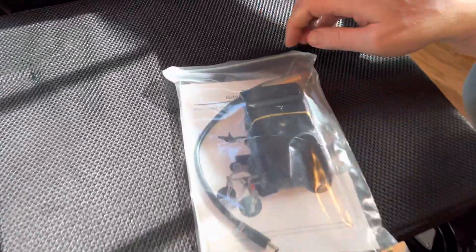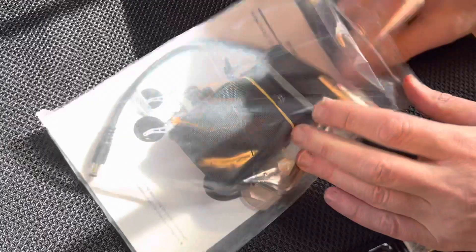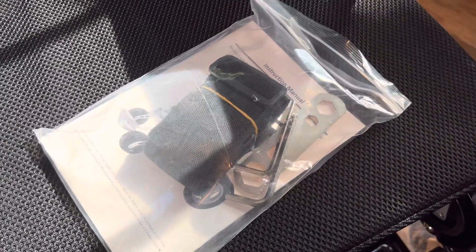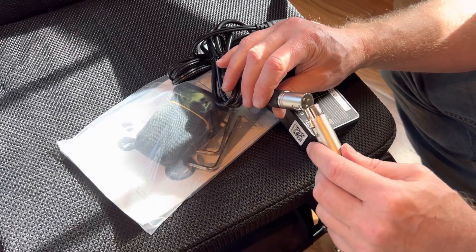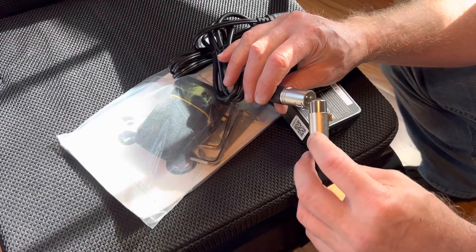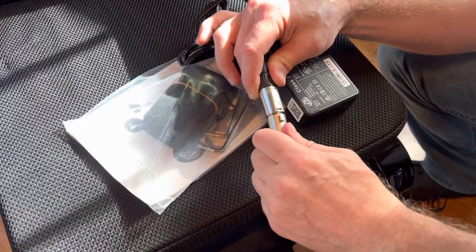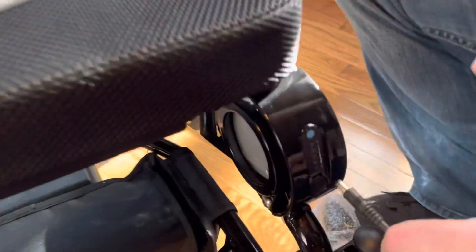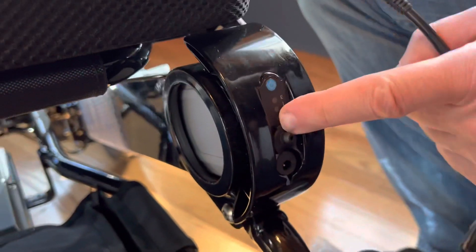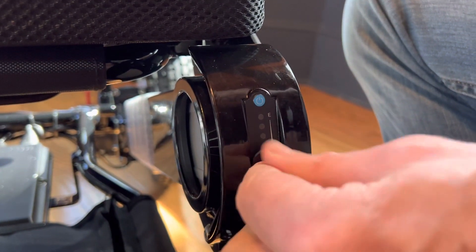Under the basket, we've got a seat belt. We have the pigtail attachment — this is great. This actually attaches right here to the charger. You can see there's even an arrow on the underside just guiding where this goes. And this plugs right into the actual battery, so you can charge the batteries outside of the chair. There's a little end cap on that battery that opens up, and I can just plug it right in and charge each battery individually, one at a time.